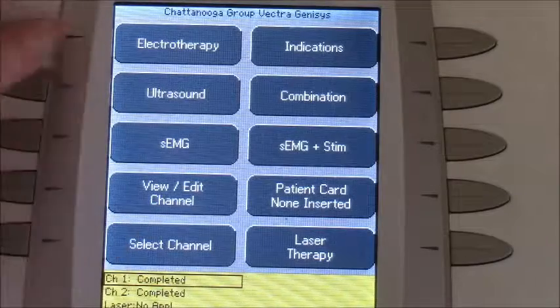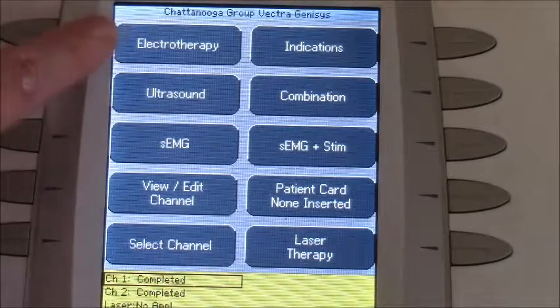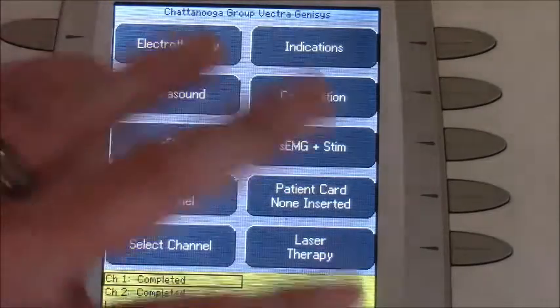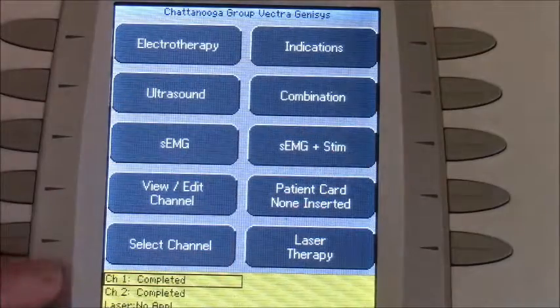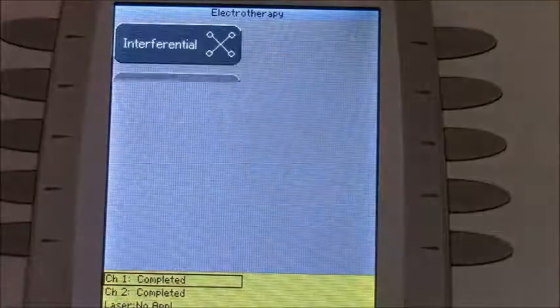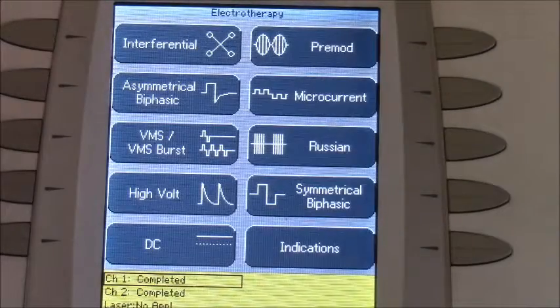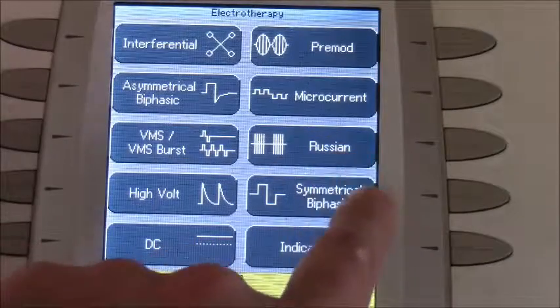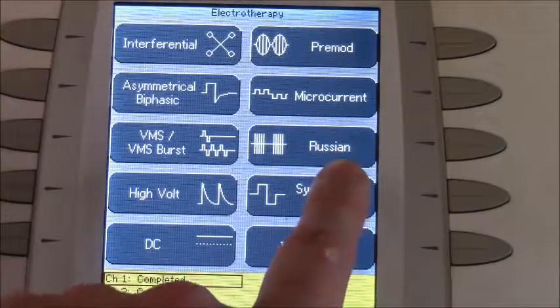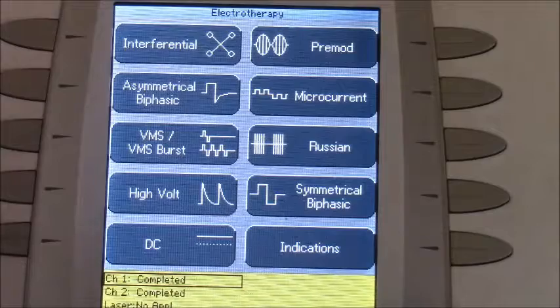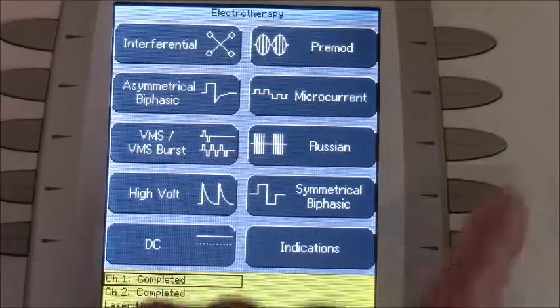This is the Vector Genesis, and the XT version is going to be the same thing — it just has a slightly different look, but the process and setup will be exactly the same. In the XT version you're going to be using Russian stimulation, and you do have the option of using whatever waveform you would like.